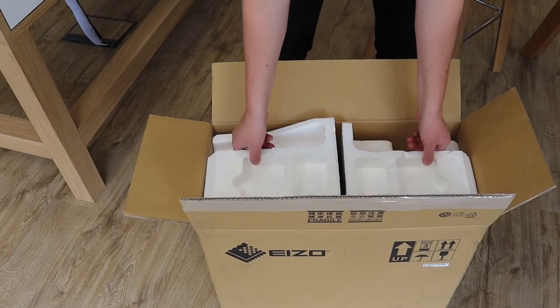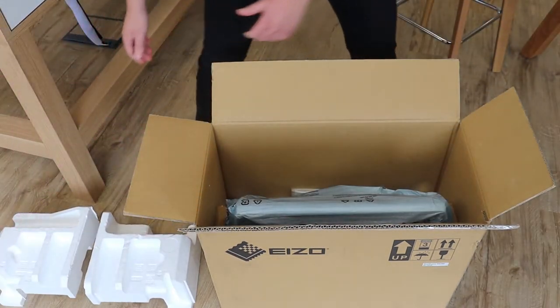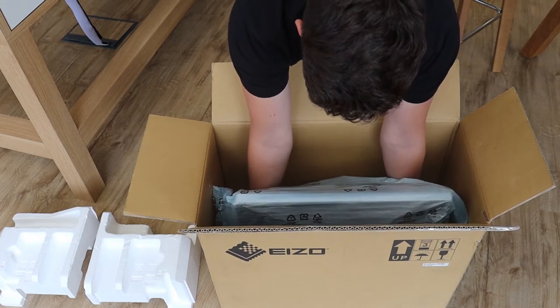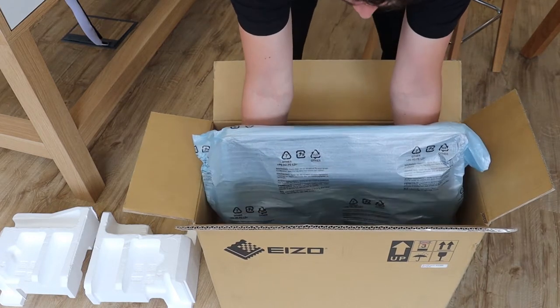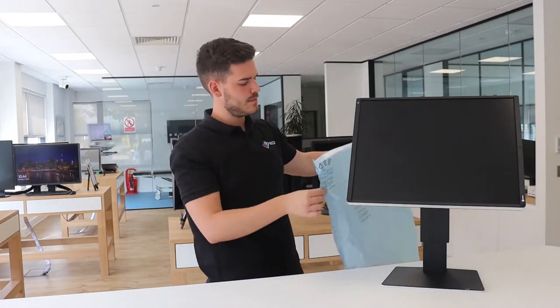To safely remove the monitor from its box, remove the top polystyrene pads. Lift the monitor up slightly so you're able to place your hands underneath, ensuring you lift the monitor while not applying any pressure to the LCD panel itself. Remove the protective bag and place this aside.